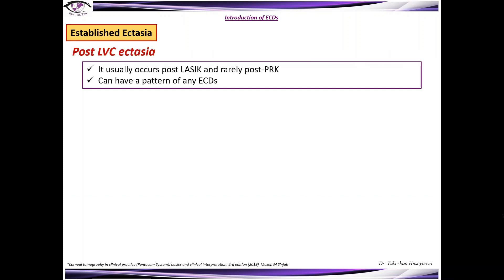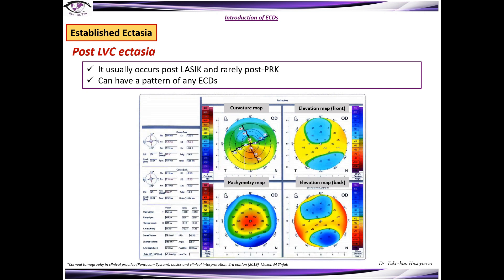Post-LVC ectasia usually occurs post-LASIK and rarely post-PRK, and can have a pattern of any ectatic corneal disease.